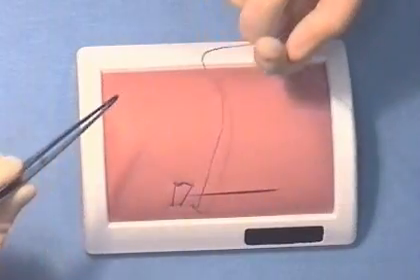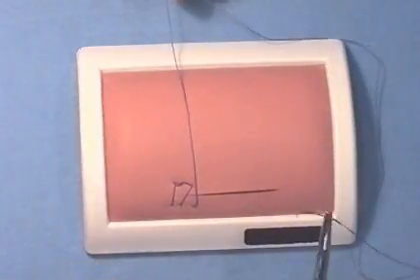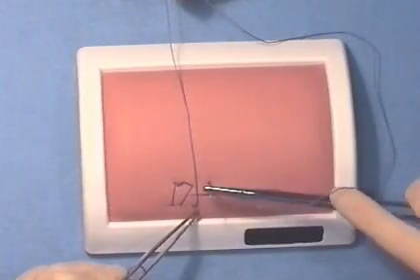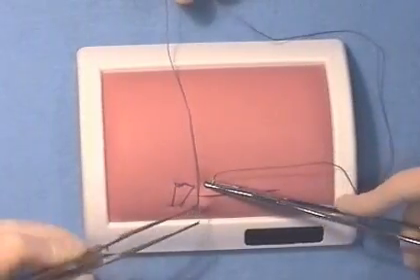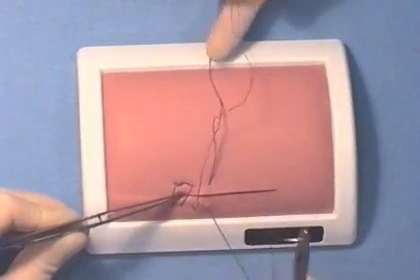The assistant and surgeon should remember that the aim of suturing is to bring well vascularised tissue together to allow healing by primary intention. Gentle traction is therefore required.